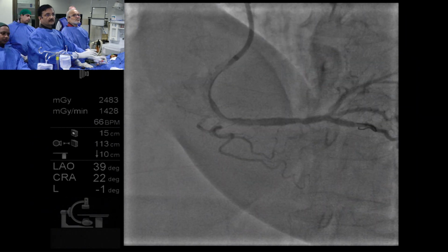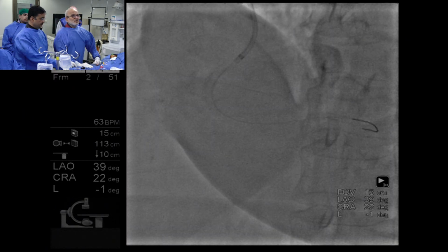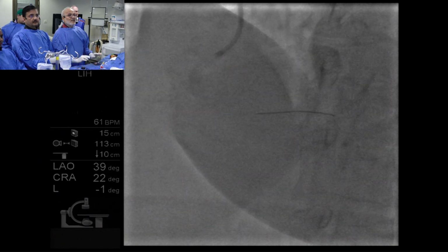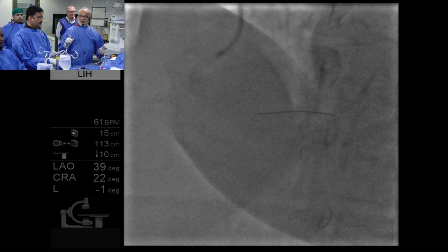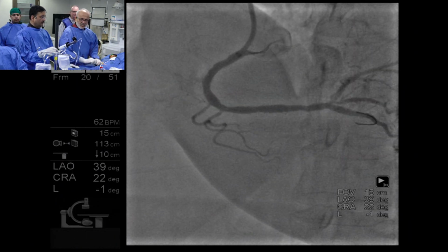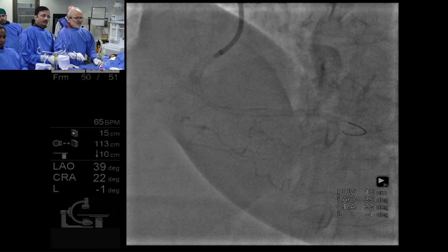Wow. It's fine. It looks good. Distal wire. Okay, fine. Now we will do OCT of the proximal part and then we conclude the case. Distal I don't want to indulge anymore. This looks good.